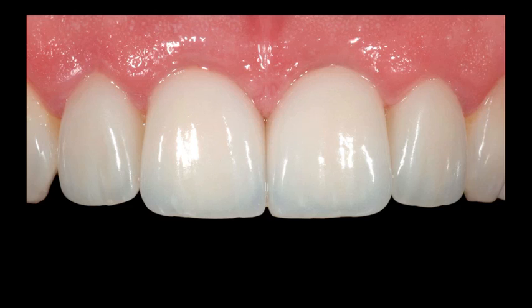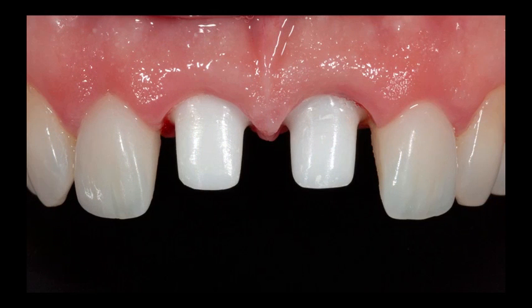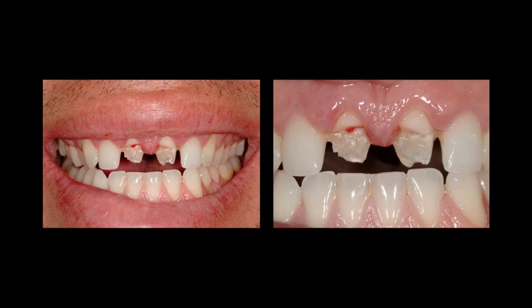Basically this is a case with two central incisor jacket crowns and two lateral incisor veneers. And the case has a pretty good gingival outline form. It's kind of what we're shooting for, with decent papilla heights and papilla volume and tissue levels. If you look deeper at the case, it's basically two central incisor implants with zirconia abutments. What I'm going to show you today will help you understand how to achieve a good tissue result when you're placing a single tooth implant in the aesthetic zone or two implants next to one another in the aesthetic zone. So here's the case when we started.